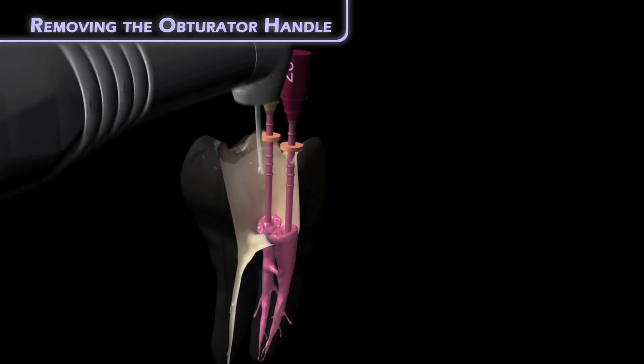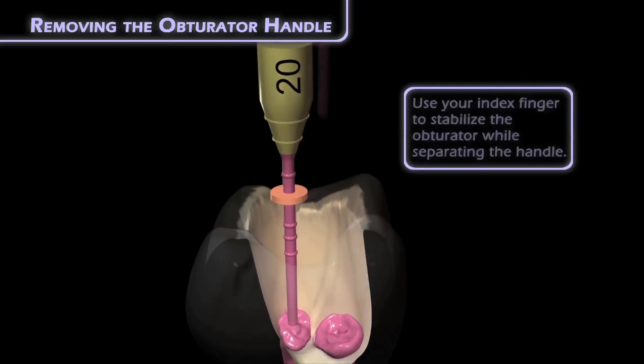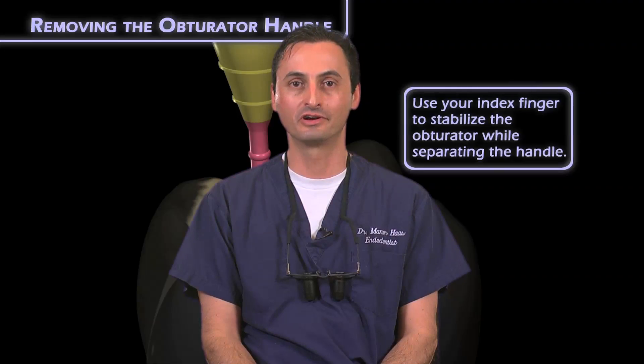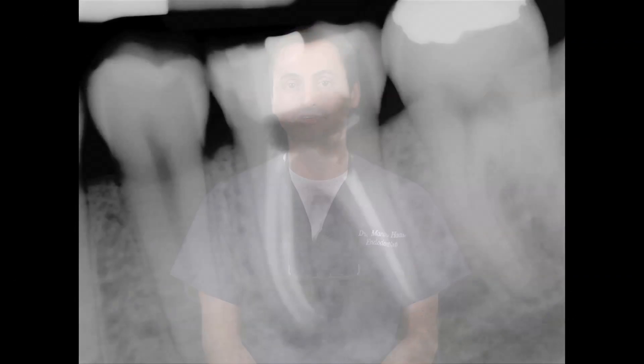If you wish, you may also use high speed or slow speed burrs for this step, but I found that there's no need to use these. I realized a long time ago the risk of using burrs to remove the carrier. As you may see in this radiograph, I unintentionally nicked and removed some of the pulp chamber wall adjacent to the distal canal while trying to remove the carrier.